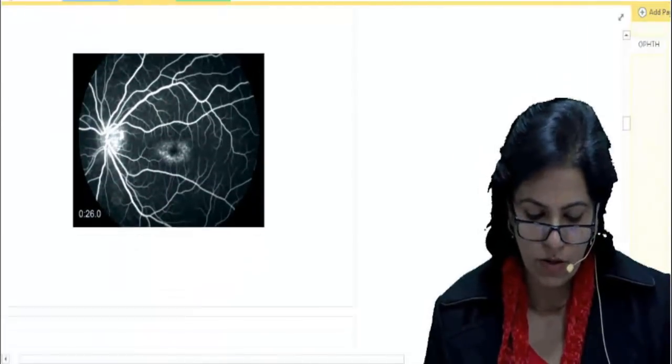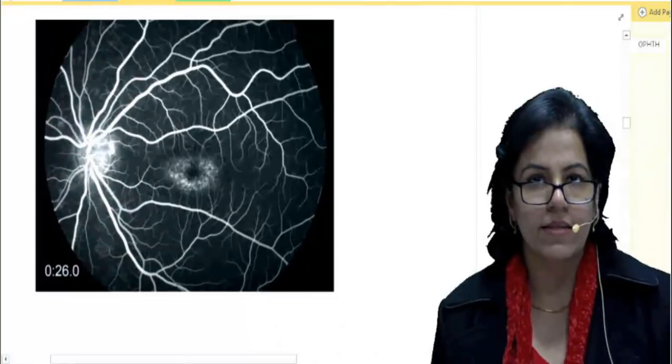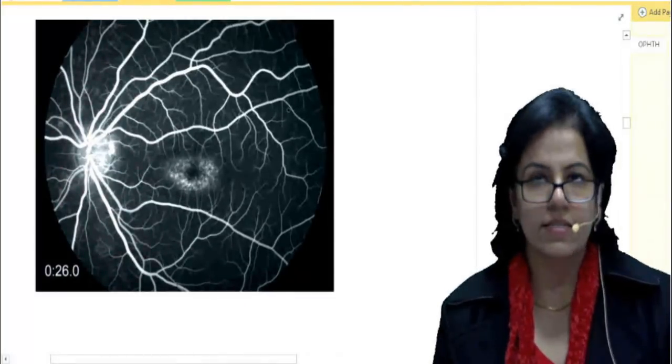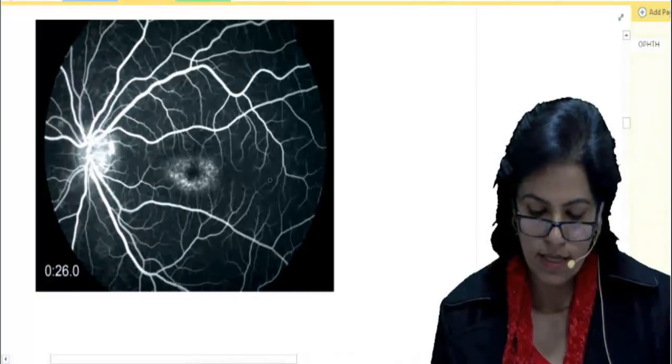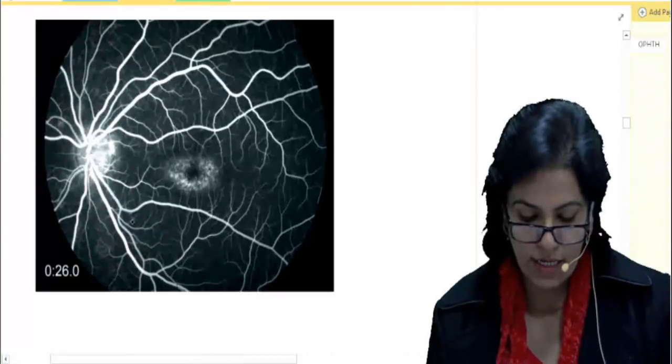Let's look at what we are talking about. See, this is your silent choroid. These are the whole background. Can you see? It is dark. This is your choroidal fluorescence which is not seen, absent fluorescence of the choroid. So, the blood vessels are prominently seen.